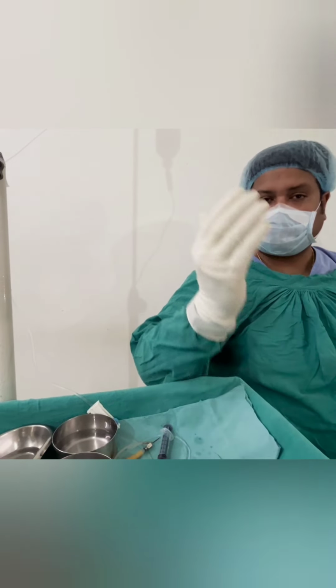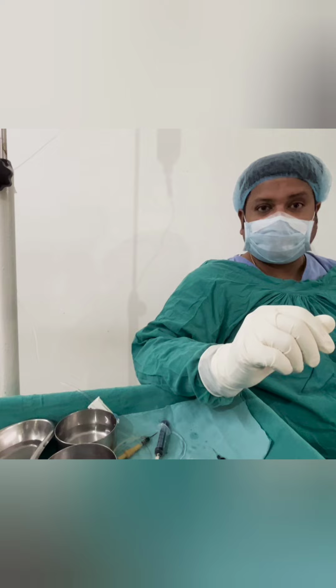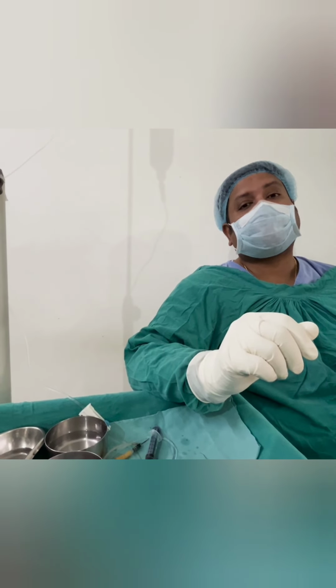When there is very thick PSCC, posterior subcapsular cataract, we have to make sure we do a thorough PC polishing at the end of the cataract surgery, because that will help prevent the secondary cataract or PCO formation.